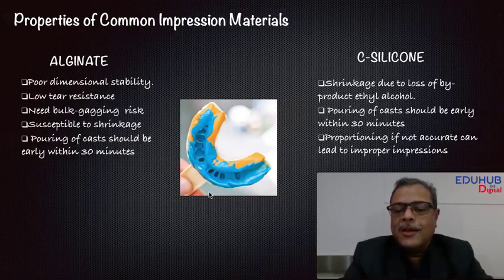So with your technique, you're very sensitive towards how you mix. Your proportioning has to be proper. You need to understand that these are the two quick ways of making impressions. However, you have to really pour these impressions immediately after you have made them.